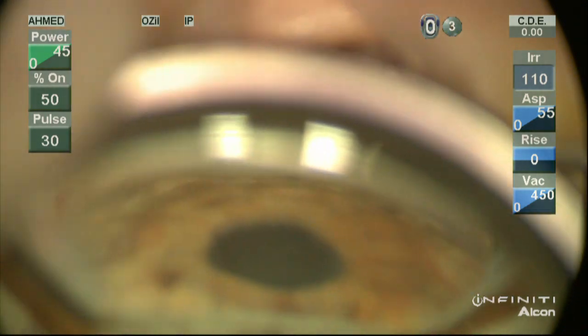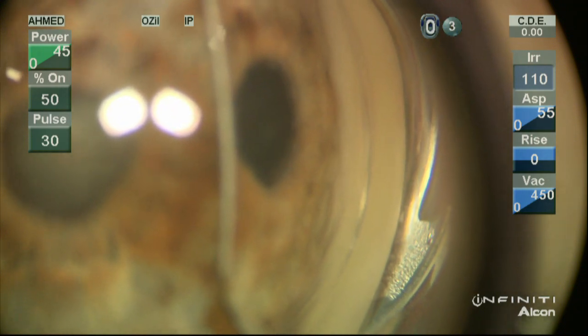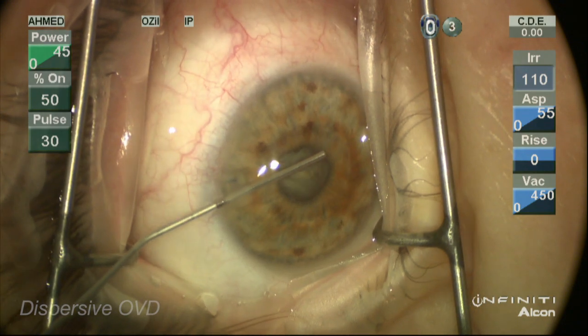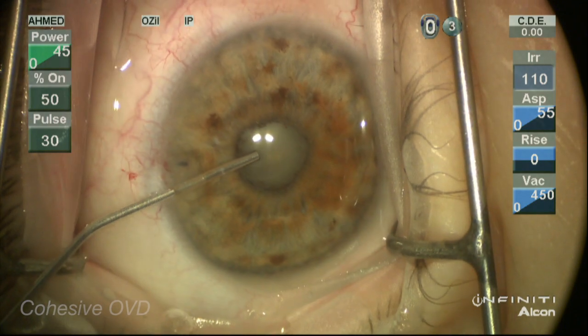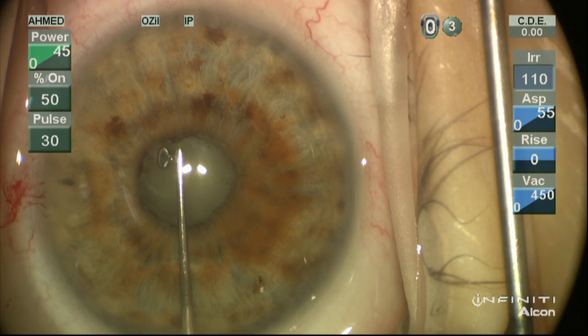The goal here is to remove this lens, open the angle up, and manage this complex eye with a shallow anterior chamber and a small pupil. We'll start by injecting our standard dispersive viscoelastic. These patients often have compromised endothelium, so a dispersive viscoelastic is important. We'll also use a cohesive viscoelastic to help create space, as space is really the first issue when managing these cases.